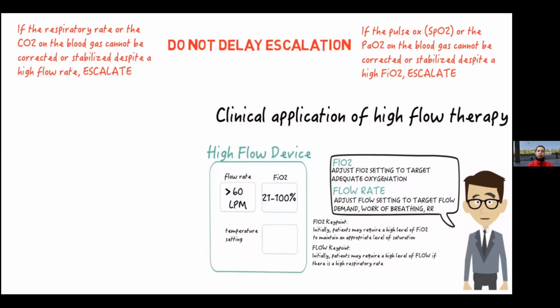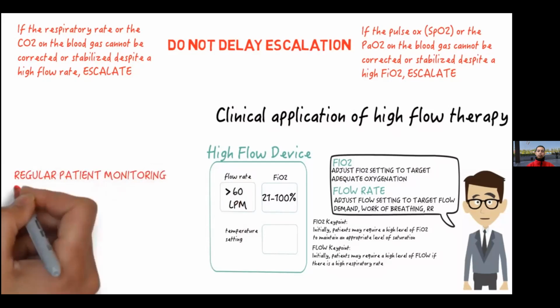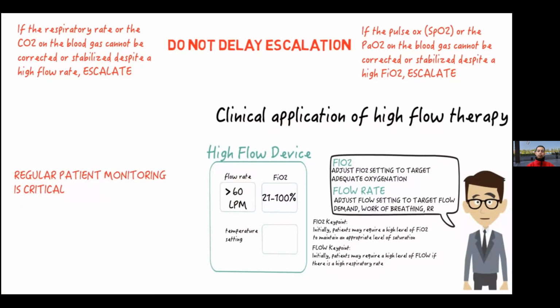Okay, now remember, because there are no patient alarms and data monitoring is not available on high flow oxygen devices, regular patient monitoring is critical.